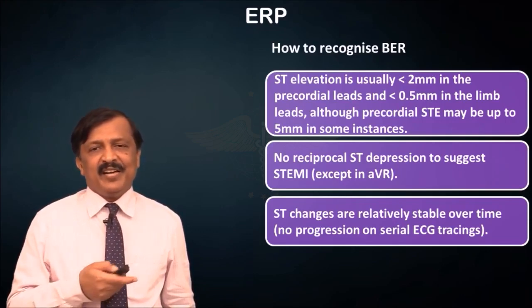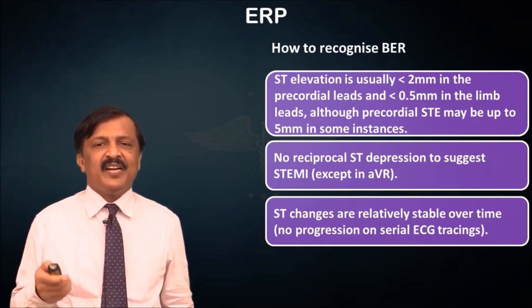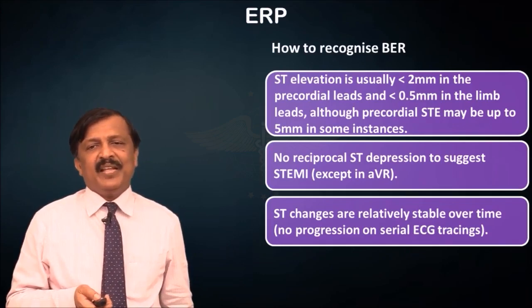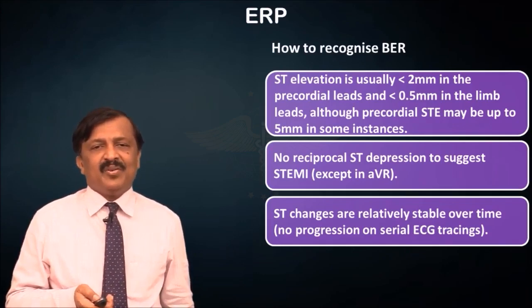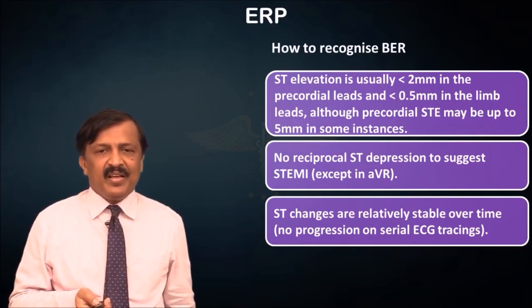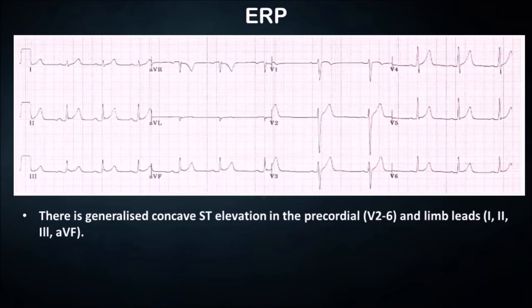It will be an asymmetrical T, where there is a long ascending limb of the T wave with a short descending limb. ST/T ratio will be less than 0.25. So these are some of the clues. And another important clue is the fish hook appearance. So here you see that there is a tall T wave, slight ST elevation, concave upwards.